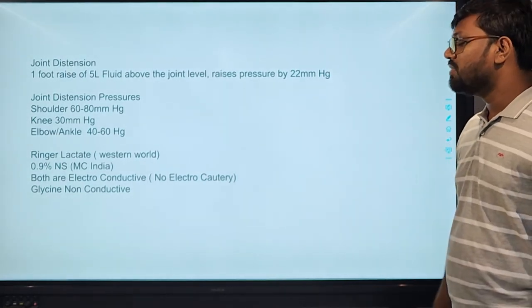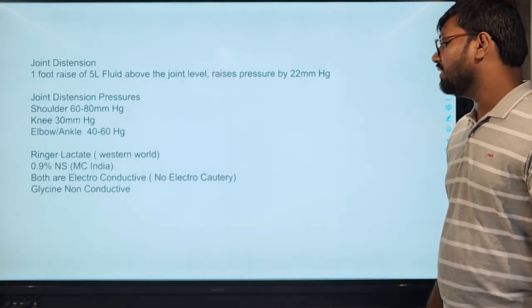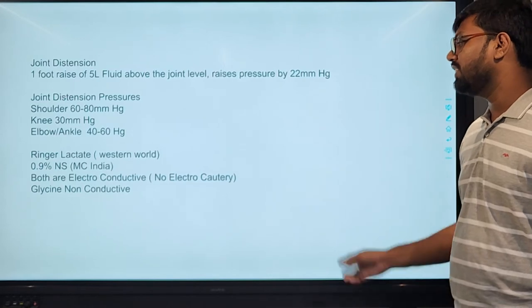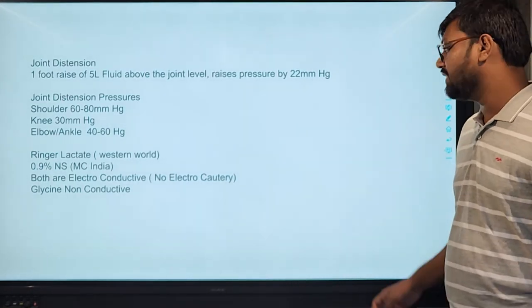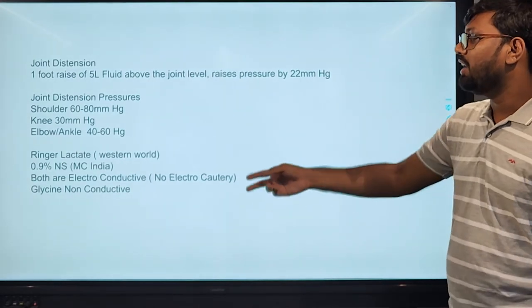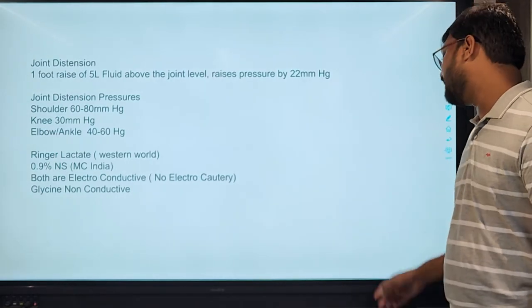We are using normal saline and Ringer's lactate. In India, we are most commonly using normal saline, but it is electroconductive, so no electrocautery can be used with that. In that stage, we can use glycine as it is non-conductive.